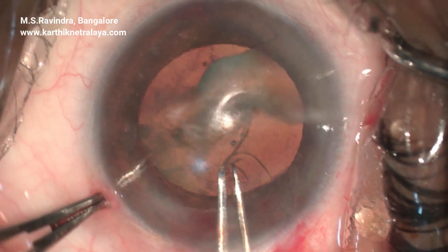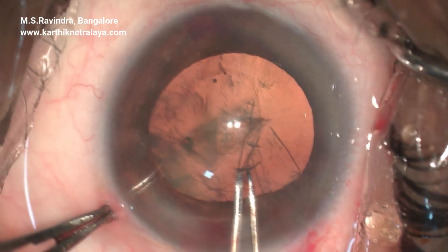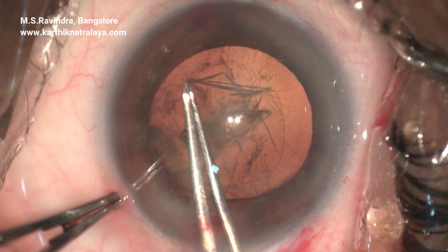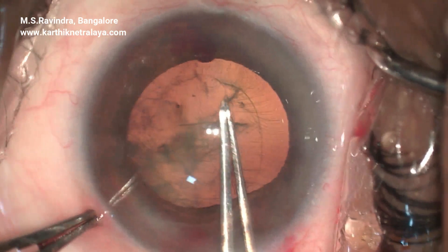You can see the zonules being stretched as the rhexis continues. Those are the long anterior zonules which don't get torn along the anterior capsular tear but are stretched and disconnected from the capsule.